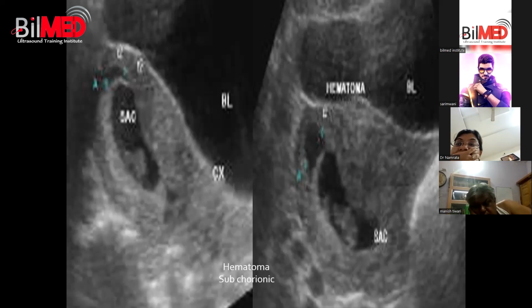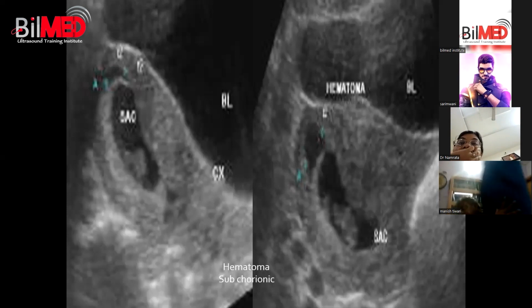So the important point is that not only do you have to label that I am dealing with the detachment of this much cc, 20 cc, 40 cc, 2 cc. Volume is important, but what I am trying to say is that more important is the location. So not only do you have to give the volumes, but the location also.